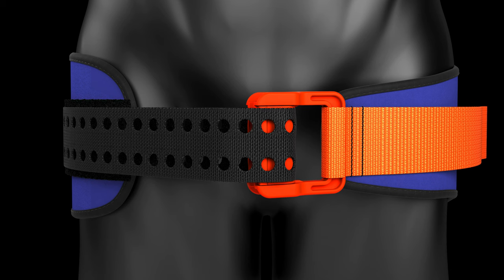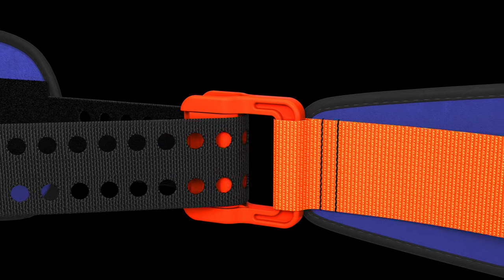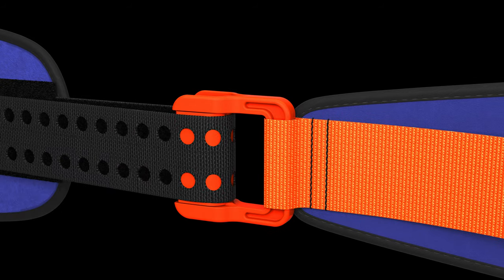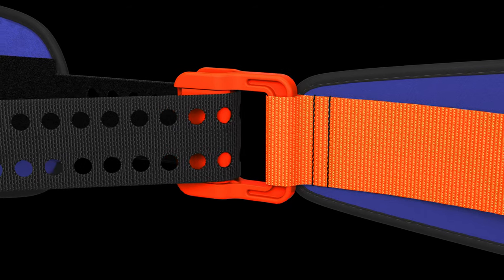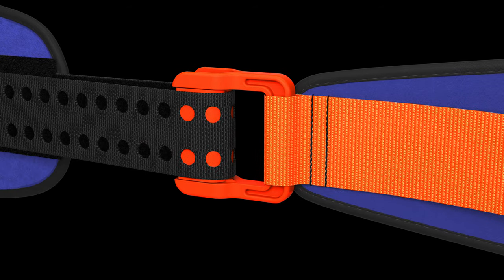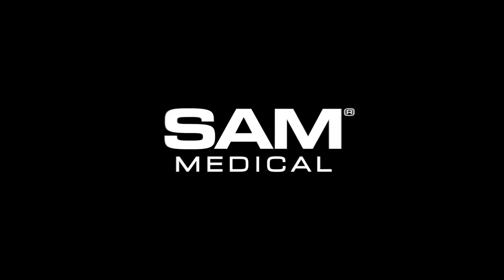The sling is secured in place with its Velcro system strap. Unlike the locking True Force buckle found on the new SAM XT Extremity Tourniquet, the SAM Auto-Stop buckle does not lock, allowing you to quickly reposition the sling for proper alignment if necessary. Learn more and discover the entire SAM Pelvic Sling product family at SAMMedical.com.